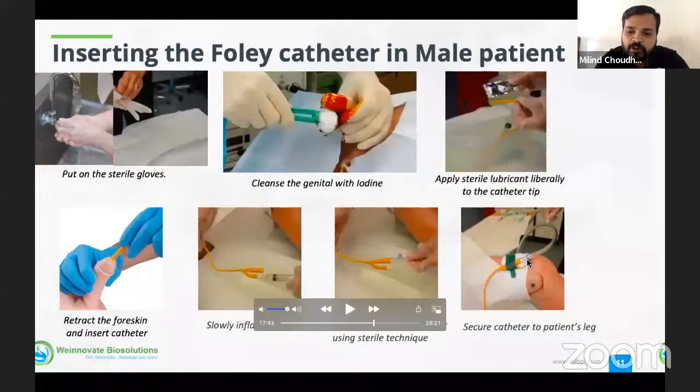When the patient is undergoing orthopedic surgery, traveling, or something like that, the urine typically comes back from the urine bag, and then it can cause infection inside the bladder. That is part number one.